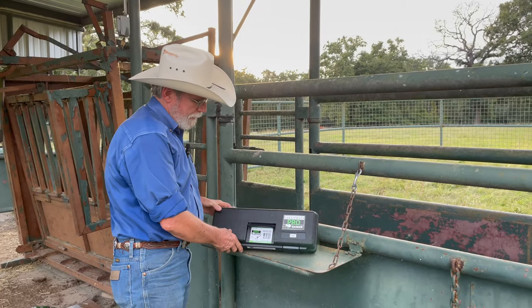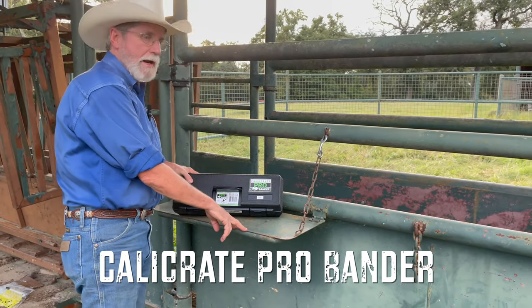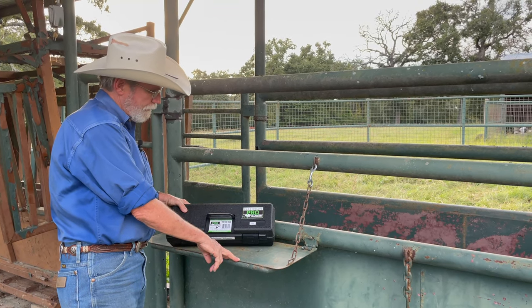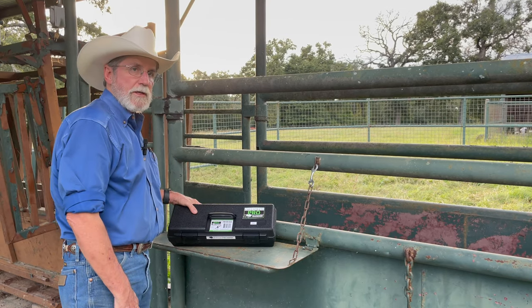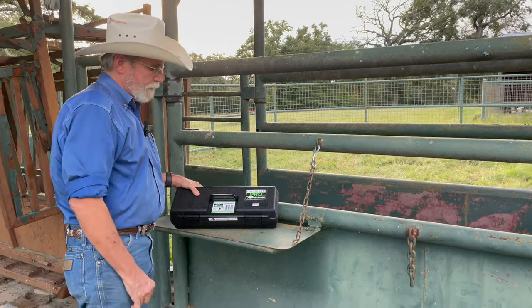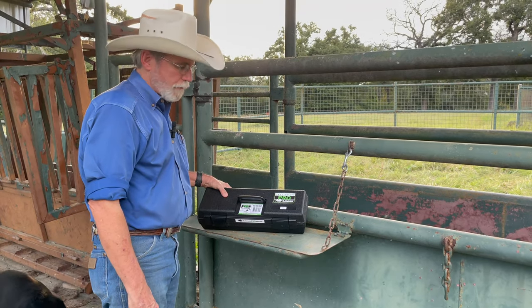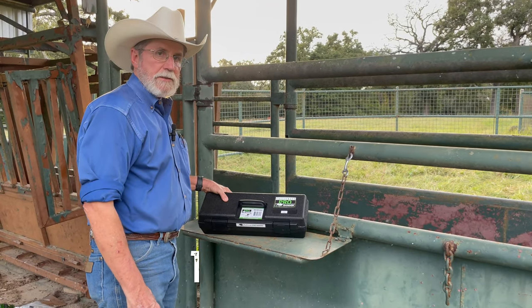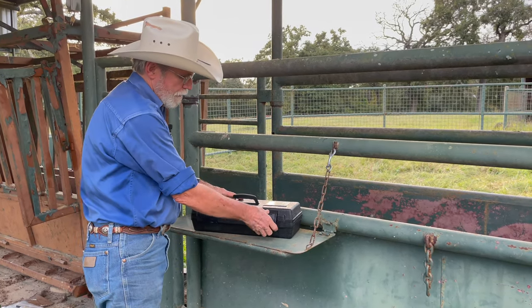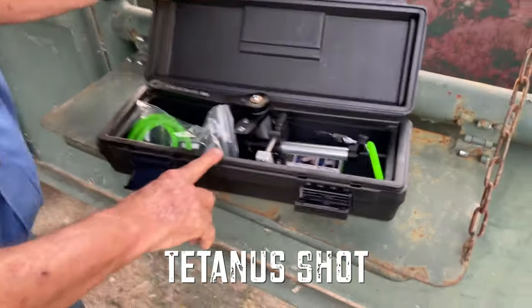I'm going to show today how to put a Calicrate Pro Bander on some bull calves. It is a device that allows castration without actually cutting the calf's testicles off. It cuts off the blood supply and the scrotum and testicles atrophy and basically slough off in 10 to 14 days. One thing you've got to make sure you do is give these calves a tetanus shot, or they could get tetanus.